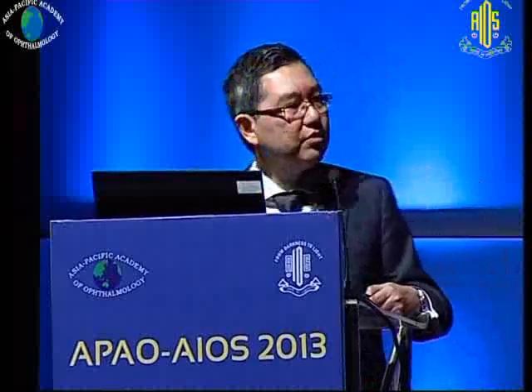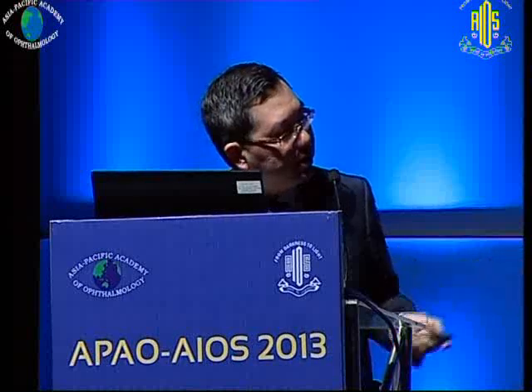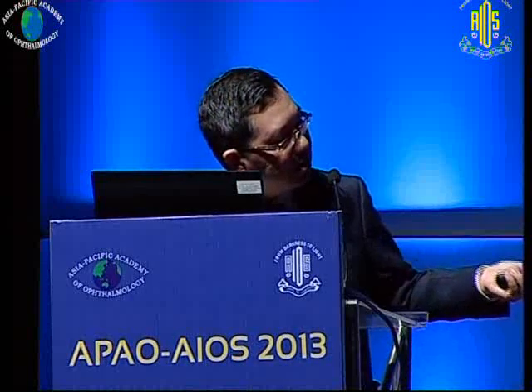It's important, I think, to understand how we arrived at diagnostic criteria, and this is the first important step toward having some kind of general universal acceptance of diagnosis. Early subretinal focal hyperfluorescence seen on the ICG, certainly within the first 5 to 6 minutes, plus one of the following: nodularity on stereoscopy, presence of a halo which was hypofluorescent, a BVN, a branching vascular network, or an orange nodule on clinical examination. And if you see massive hemorrhage and certainly pulsatile filling, this is seen on the video angiography of the SLO, these were all important criteria that allowed the diagnosis of PCV. And these were the results.